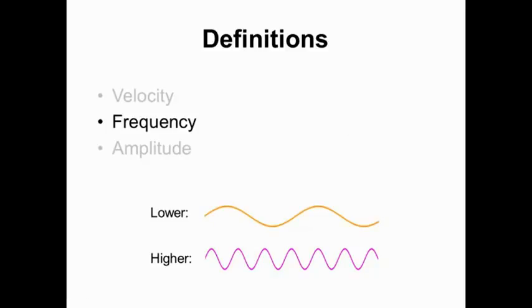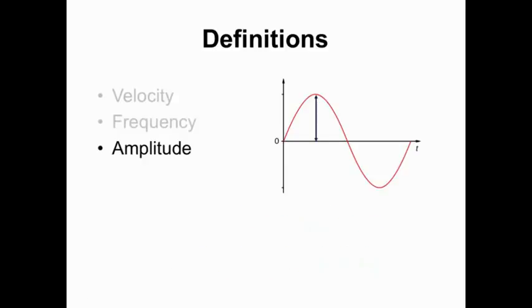The frequency of waves created for medical ultrasound purposes depends on the probe and settings used, both of which will be discussed later. Amplitude is defined as the peak deviation of oscillations from the baseline and for ultrasound is measured in terms of pressure. Think of amplitude as the loudness or intensity of an ultrasound wave. If you superimpose the waveforms from the previous page, you can see that, while the frequencies are quite different, the amplitude of each wave is the same.